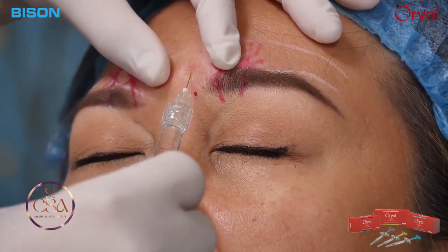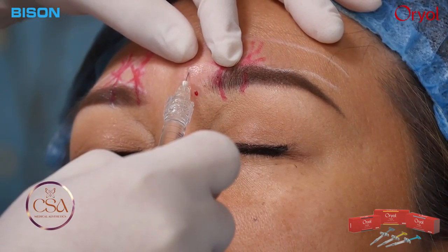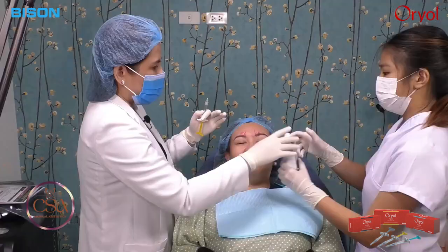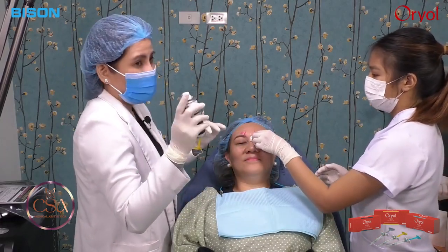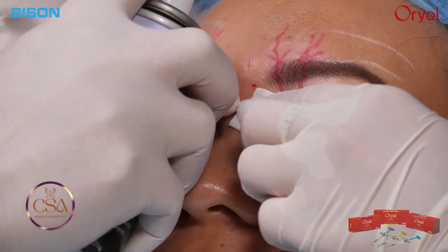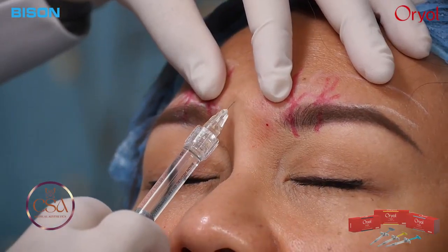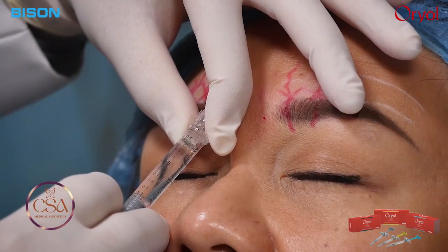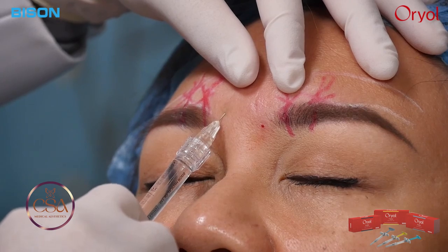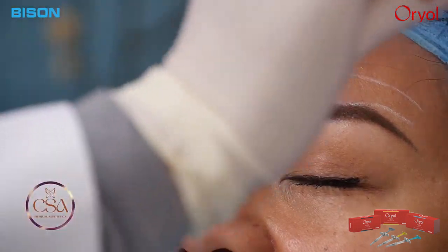There you go. Since she had a neurotoxin a month ago, we can actually do a minimal touch-up of the neurotoxin. Okay. So I have my pain freeze for numbing. It's just a cryogen spray. Okay, close your eyes and then spray on the area that you will inject. There you go. So I'll just treat this last one here. Usually I only use 0.2, 0.3 of my product in this area since we only have a mild static line, a grade 1 problem. So that will be enough. Okay, there you go, it's done.